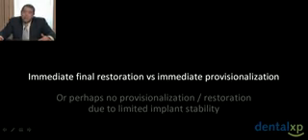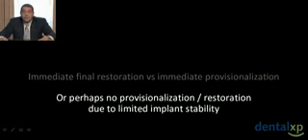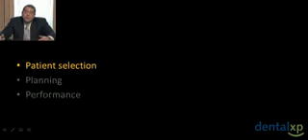There are technologies that employ the ability to go ahead and do final restoration as opposed to just immediate provisionalization. We have to be very careful with this because, again, the final determination of whether or not the implants can be loaded is going to be made at the time of implant placement and can't always be done just by looking at the CT images. So sometimes we can't do the final definitive restoration. Sometimes we may even make the decision at the time of surgery that that implant or particular implants should not be immediately loaded or provisionalized due to the limited implant stability in that area.